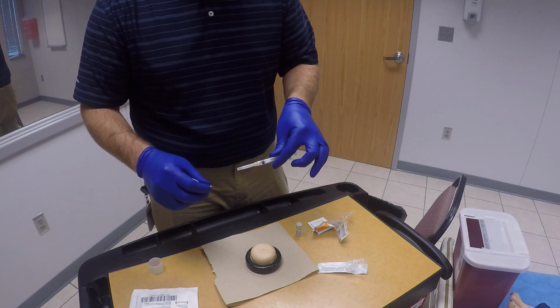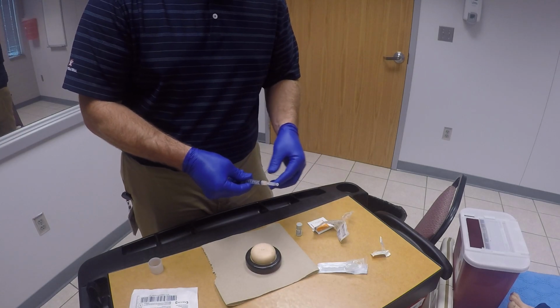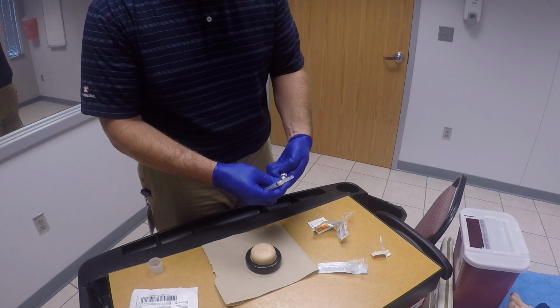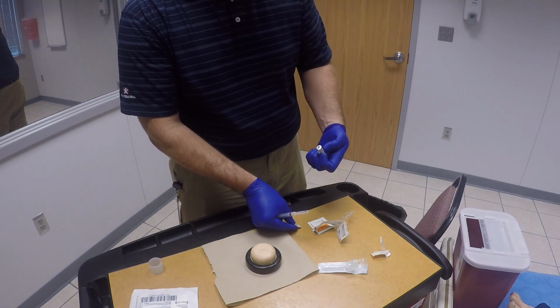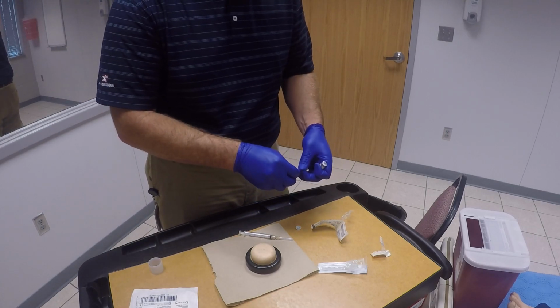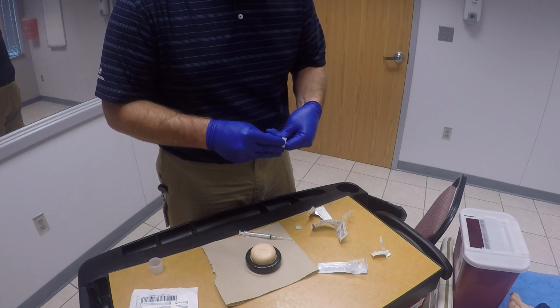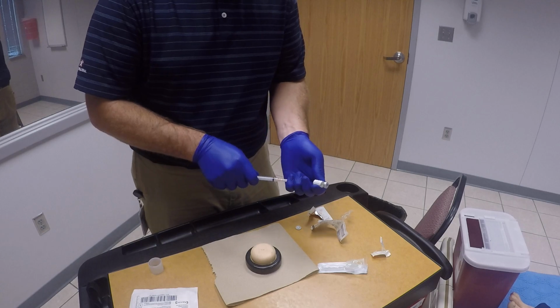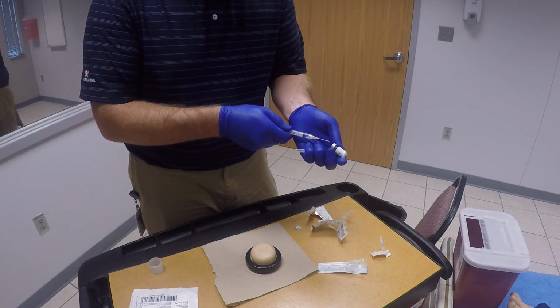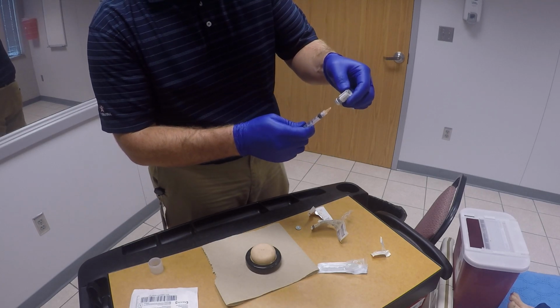So we're going to do that, keeping it all clean, and go ahead and attach that. Attach the needle to the syringe. Go ahead and remove our top there, and we can cleanse the top of that with an alcohol prep pad, if there's any reason that it might have been contaminated or anything like that. Remove our cap there. We'll actually put just a little bit of air in there and then draw up the medication that we need, the amount of medication that we need.